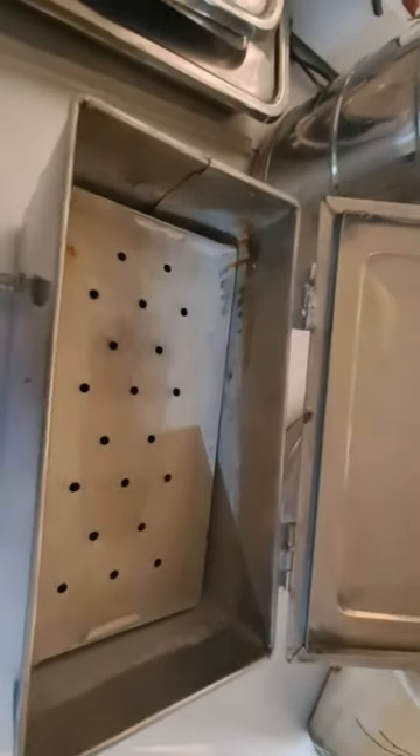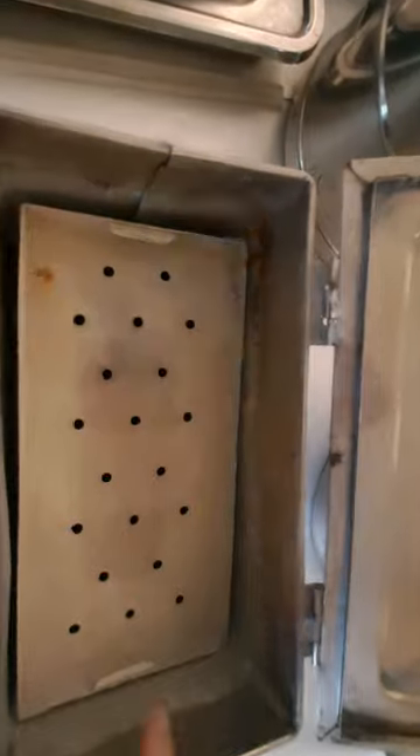This is the cheapest method of sterilization at small places. This is the setup of boiling water. Thank you.